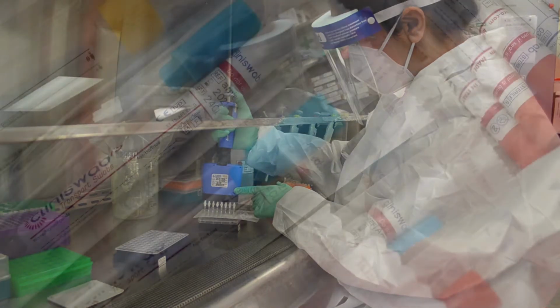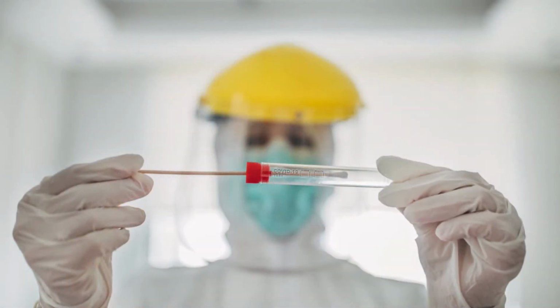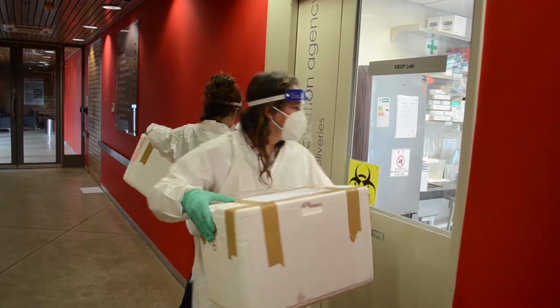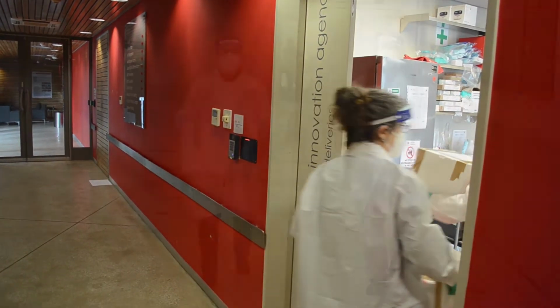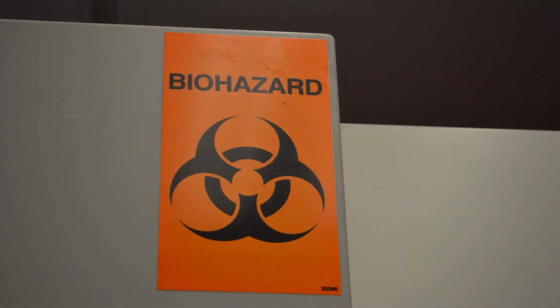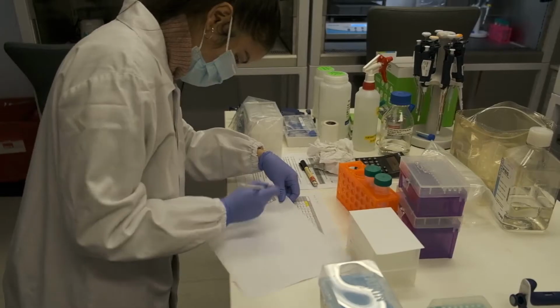steps involved. Step 1. Obtaining nasal swabs from public and private testing centers. A long swab is used to collect potential virus particles from the back of the nose and deep in the throat. Step 2. Receiving samples at the lab in a biosafety box. Samples are shipped by courier to accredited labs with the necessary skills, experience, and the proper safety procedures in place.